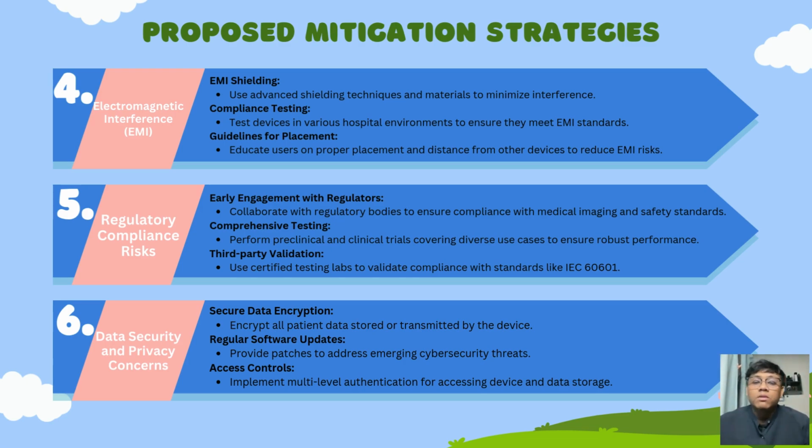For the last, third-party validation. Use certified testing labs to validate compliance with standards like IEC 60601.